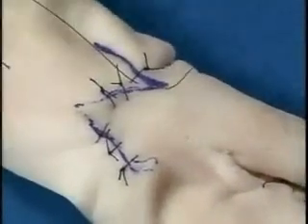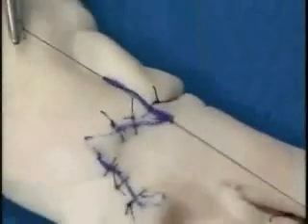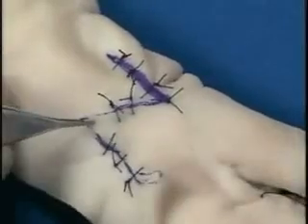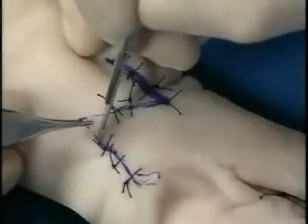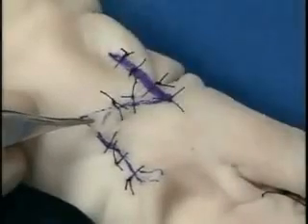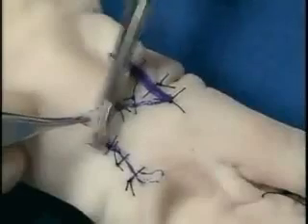defect are closed. The remainder of the tissues are closed according to the principles of halving. Now we can see that there is this excess. We now will cut this triangular excess off so that the flap will inset nicely into the region of the defect. This can be trimmed off with either a pair of scissors or with a 15 blade.